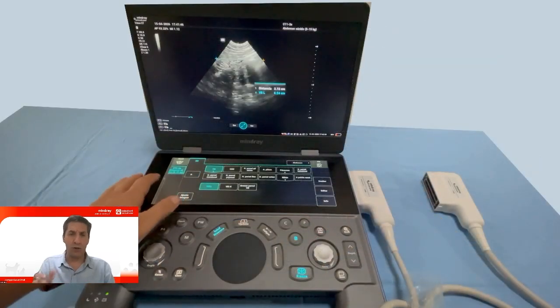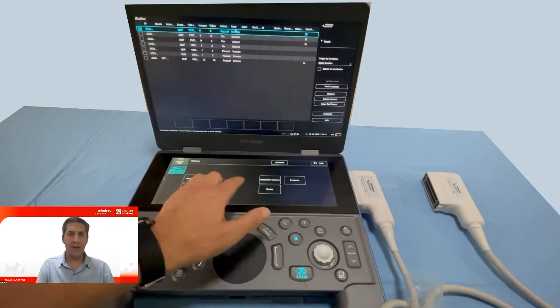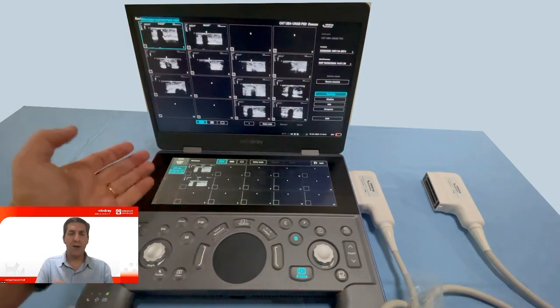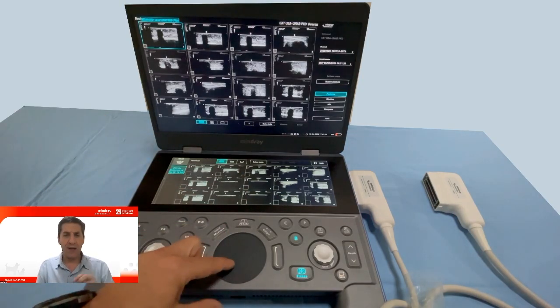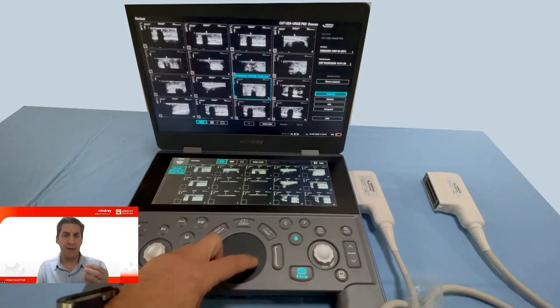It is also important to be aware of the different settings of the ultrasound machine, especially those that allow us to save our procedure. This is super important, not only to give information related to the procedure we perform, but also to make a retrospective analysis and to help complete our learning curve. We can even share information.